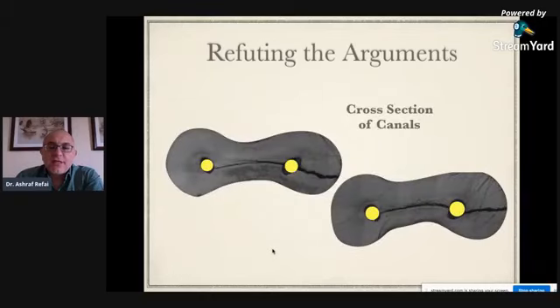Not to mention that canals themselves are not necessarily round. This is also a misconception. Just because you inserted a rotary file inside the canal and prepared it, that doesn't mean these canals have become regular tubes or regularly circular in cross section. So you can have an irregular canal, and you can place in a regularly tapered instrument, and there will be a discrepancy between the canal walls and the instrument themselves.